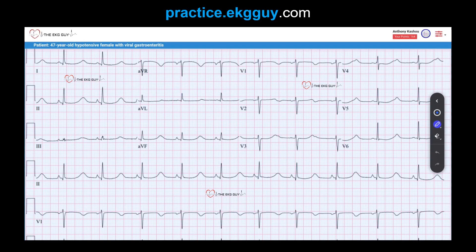Here we have an ECG obtained from a 47-year-old hypotensive female with viral gastroenteritis. There are quite a few important findings here, so let's go through them. First, notice the presence of upright P waves in lead 2 and inverted P waves in lead AVR, suggesting a normal P wave axis. These findings, in addition to a constant P wave morphology, regular P-to-P intervals, and an atrial rate of around 60 beats per minute, all favor normal sinus rhythm.